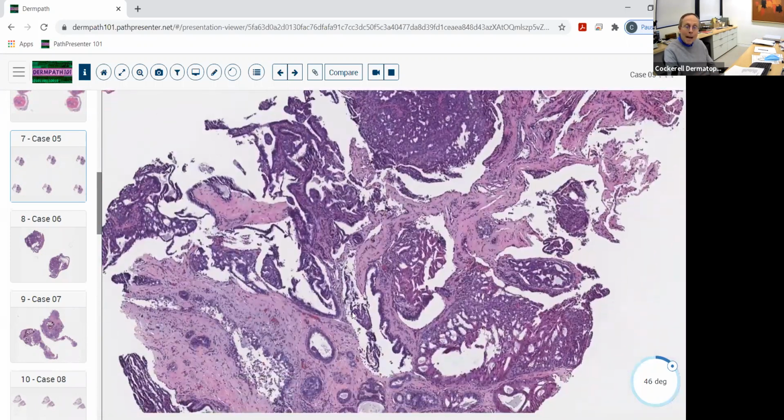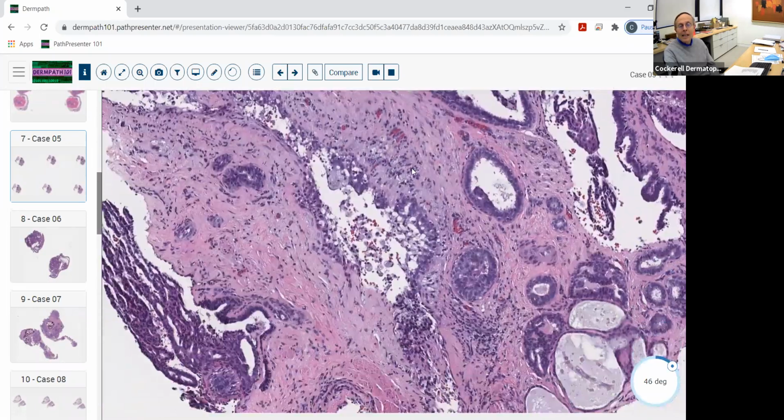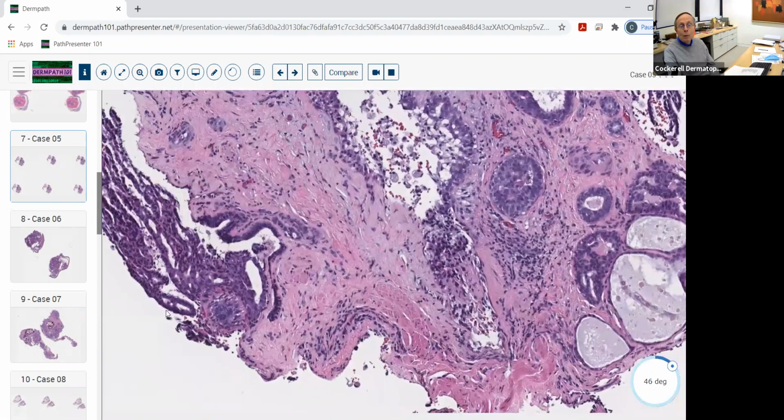Would you call this a papillated apocrine cystadenoma? Well, you might, but when it occurs on the nipple like this, we call it a nipple adenoma. And there's a condition known as erosive adenomatosis of the nipple, which presents usually as a reddish, friable, verrucous area. And this is, again, an apocrine lesion.